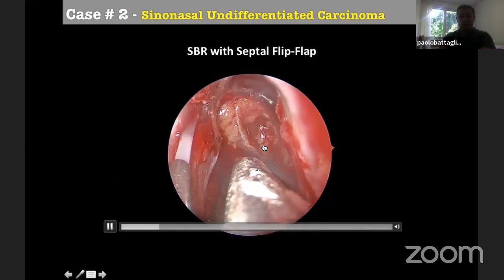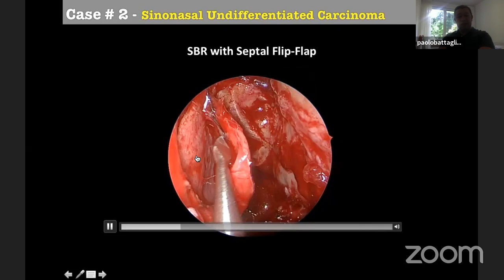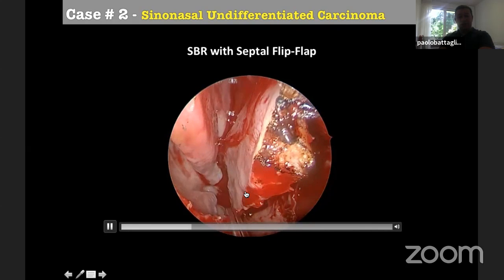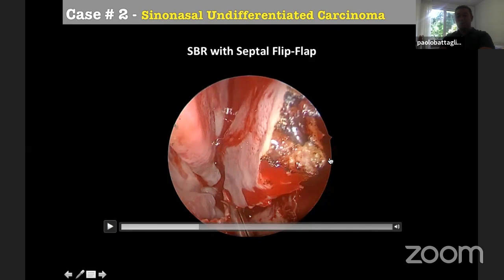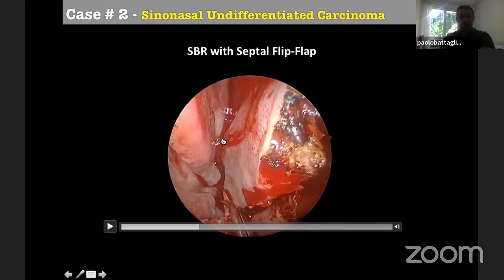Here, the duraplasty, fascia, and some fat, and then anterior incision and inferior incision. Here, I did not remove too much of the periorbit, so I did not extend my flap on the nasal floor. Here, this is the right side. You see, inferior turbinate of the right side, middle turbinate, superior turbinate, and here there will be the natural ostium of the sphenoid on the right side. So anterior incision and inferior incision.